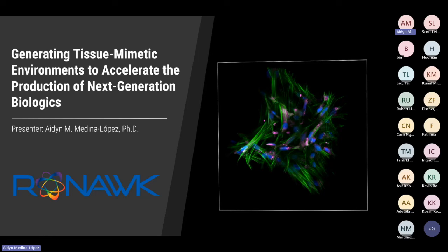Now, what we recommend is that you not add just one, add several. That way you can use those daughter blocks for the experiments that you need. But this will retain and maintain a constant culture of your cells.